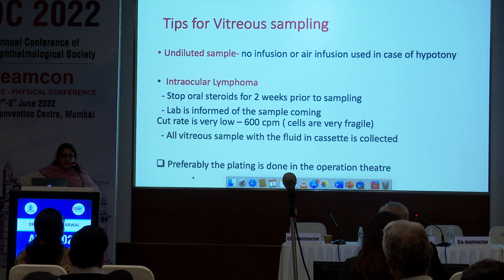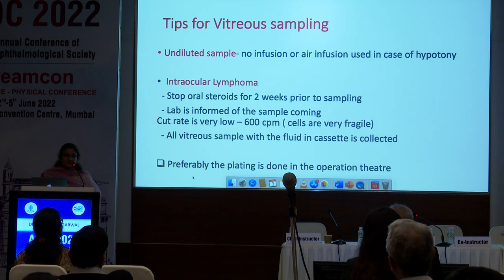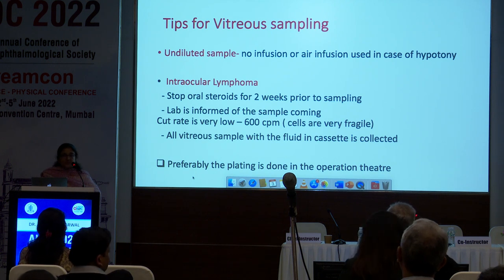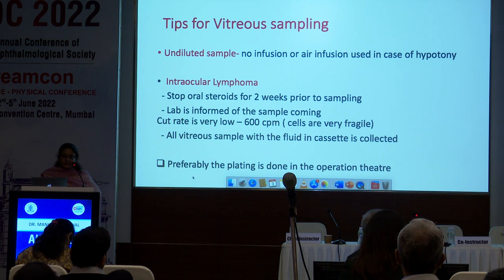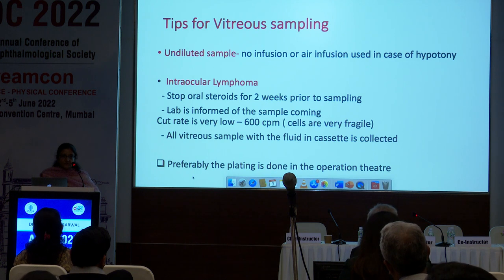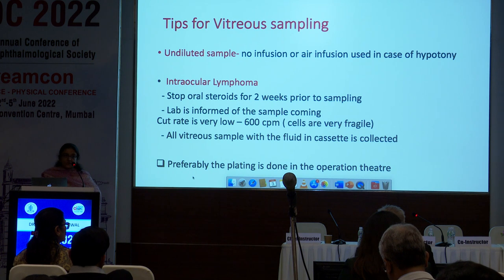Now, as far as certain special tips for vitreous sampling is concerned, I already told you it's a good idea to connect it to an air infusion rather than a fluid infusion, because this avoids the dilution and avoids hypotony. Now, coming to intraocular lymphoma, we have certain special things which we have to keep in mind. One is that we have to stop the oral steroids about 2 weeks prior to sampling. We all know that the intraocular lymphomas respond to steroids and your yield is going to be much less. So if you are suspecting an intraocular lymphoma, it's a good idea to stop the steroids at least 2 weeks prior to you collecting the sample.